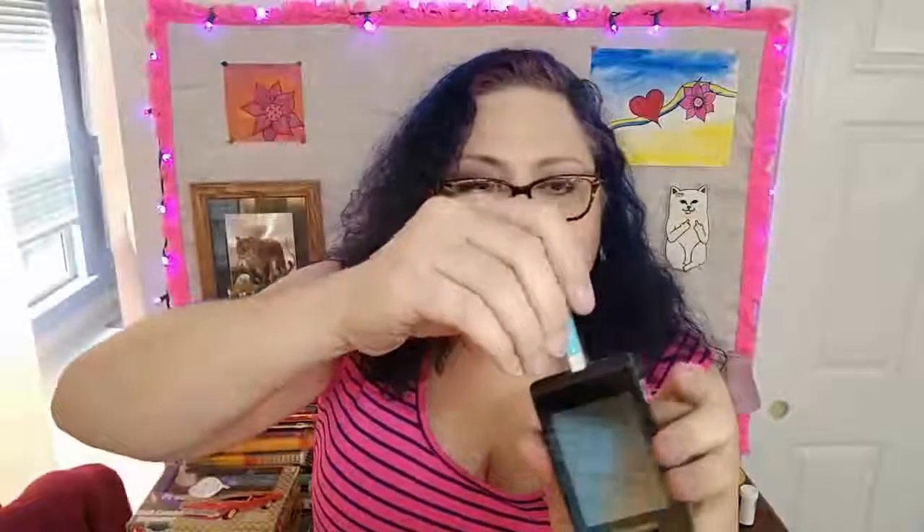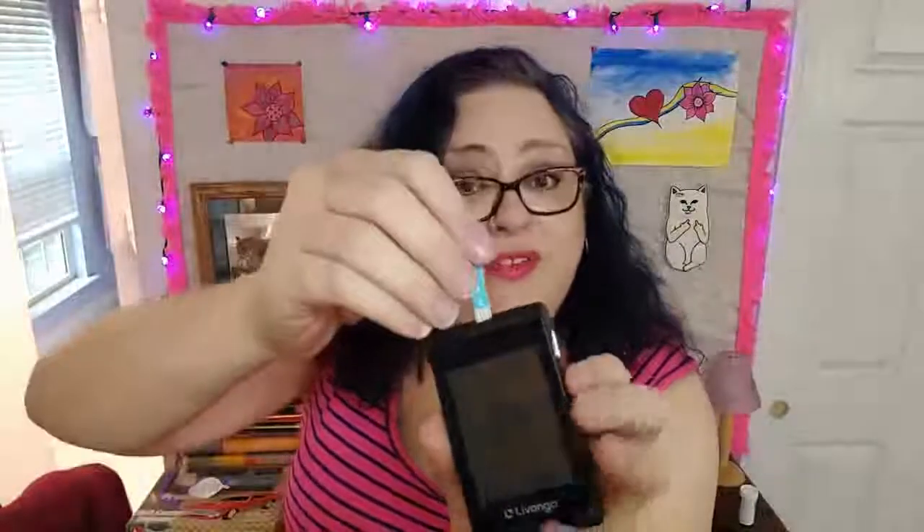This is a test strip — I'll come in closer. This one says Livongo right on it. Most of them will have their names on it; they're very proud of their test strips. This little end here is where the blood goes in, and this end is what goes into the meter itself. I took it out of its little case just for easier showing, and you let the printed side face you.